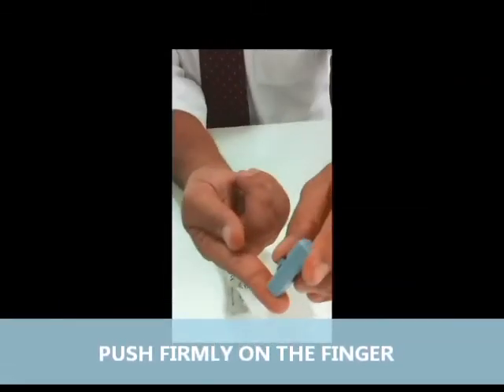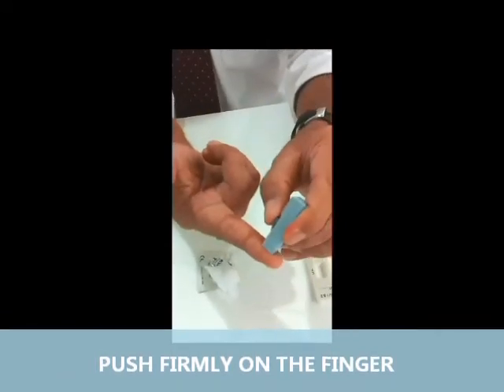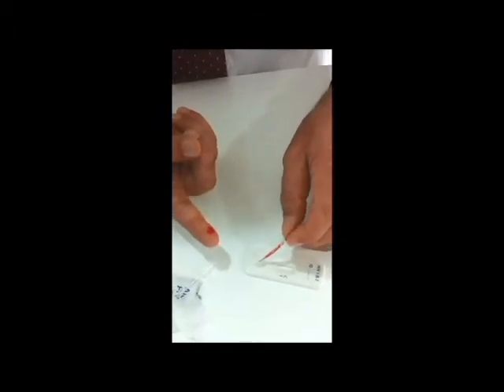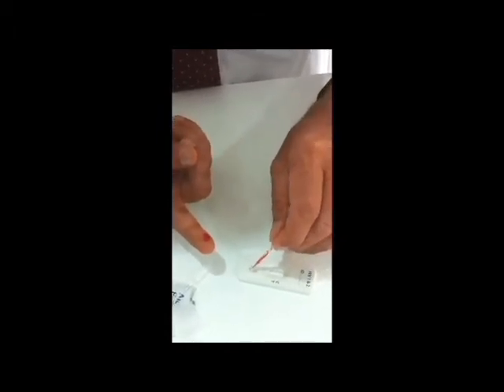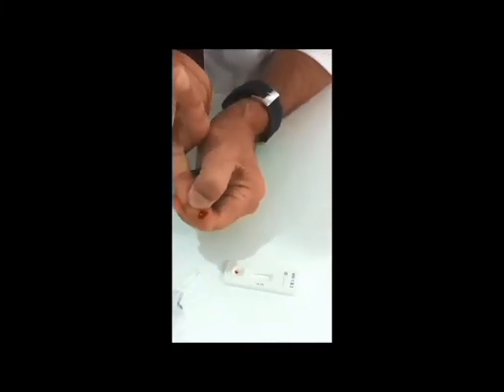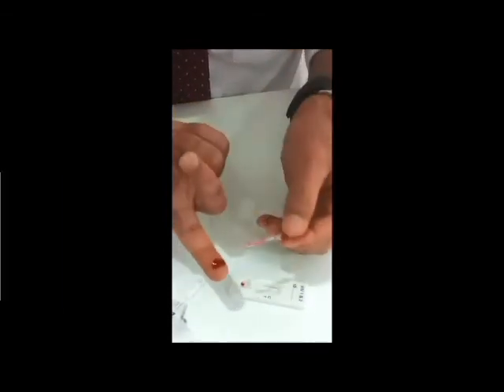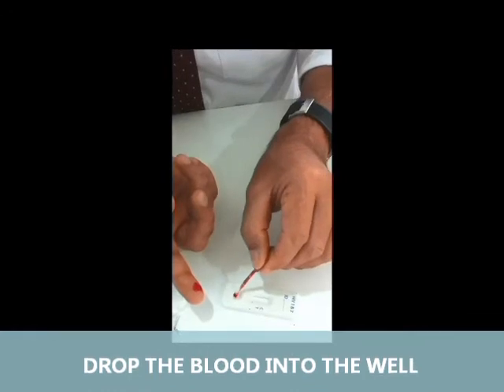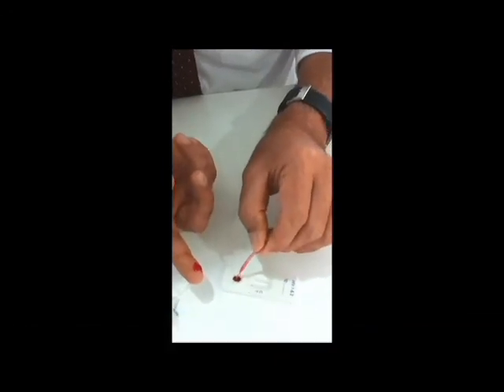I'll use this finger, push it with my finger, and squeeze the trigger. There, I've given myself a little blood. Squeeze the pipette tight and suck the blood up. Then squeeze the blood back into the bottom of the well. You might have to get some more blood out sometimes — this is a natural, real-time thing that can happen.